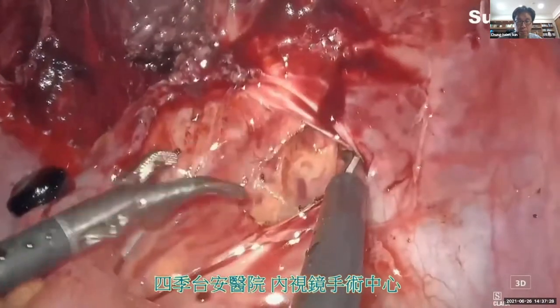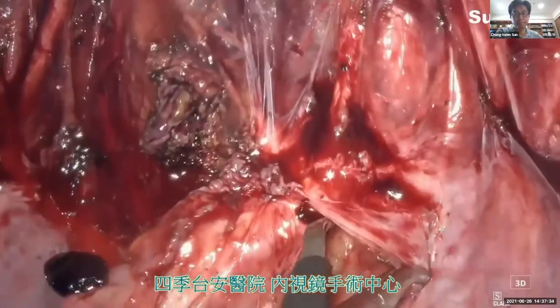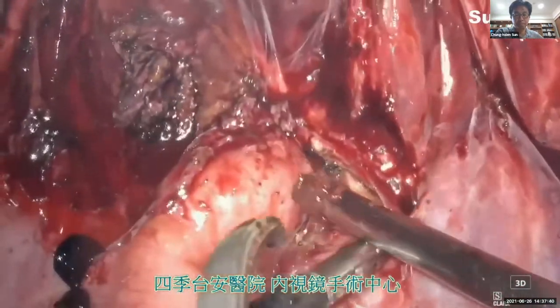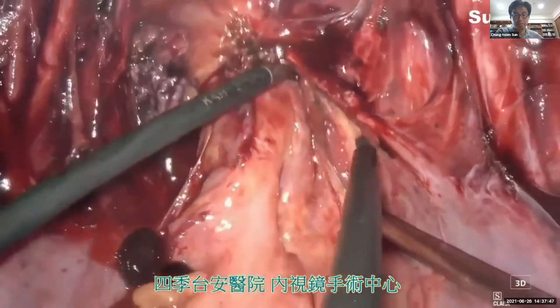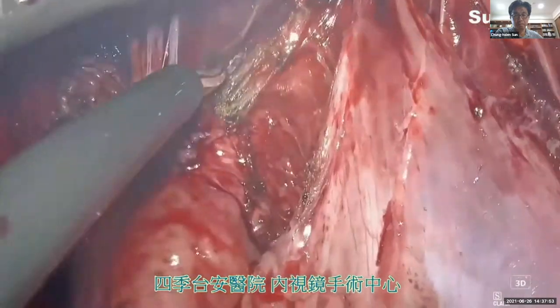There is still some adhesion between the rectum and the right uterosacral ligament. So again, we enter the right pararectal space, separate the rectum away from the right uterosacral ligament. Again, fat belongs to the rectum, so we keep all the fatty tissues along with the rectum.